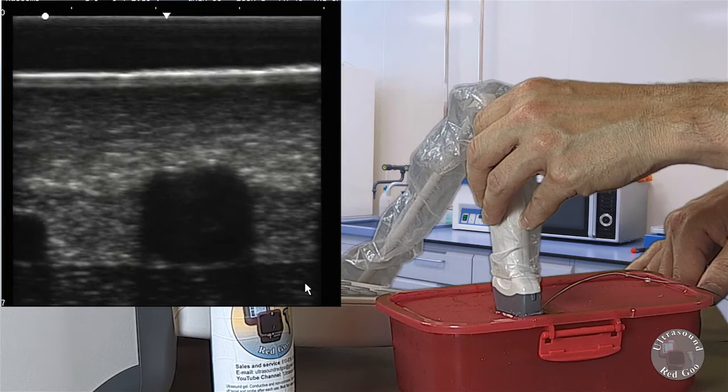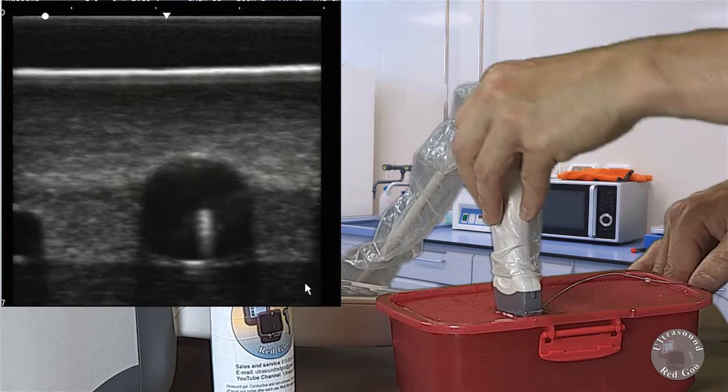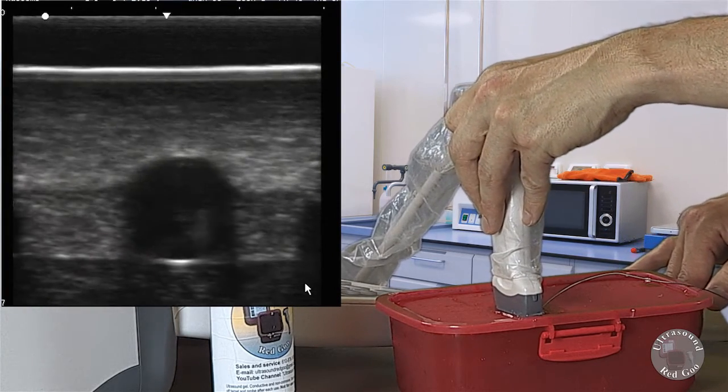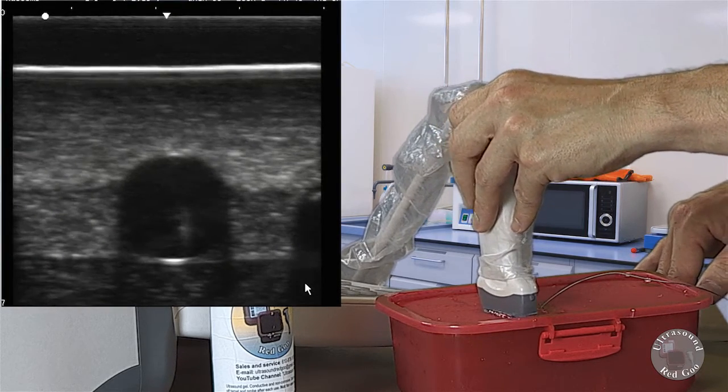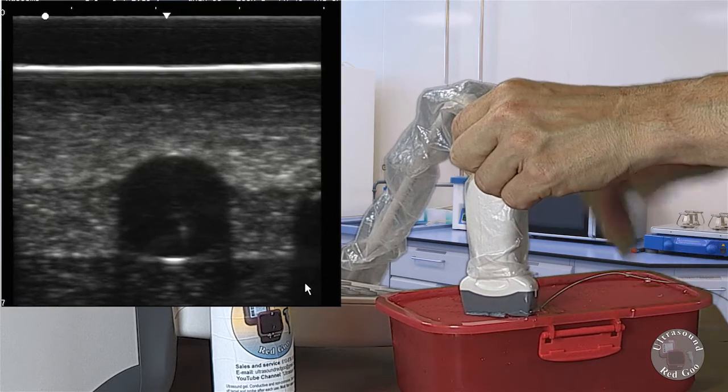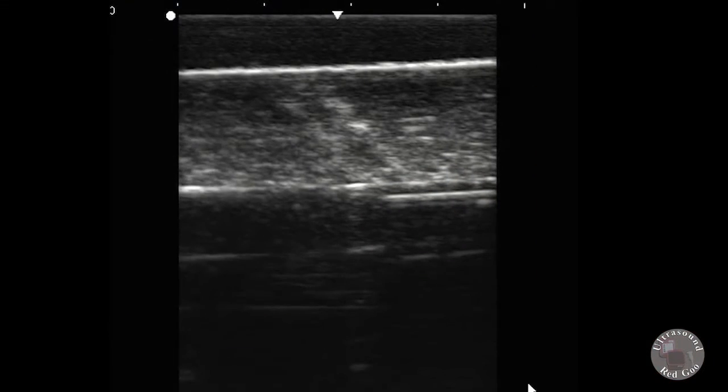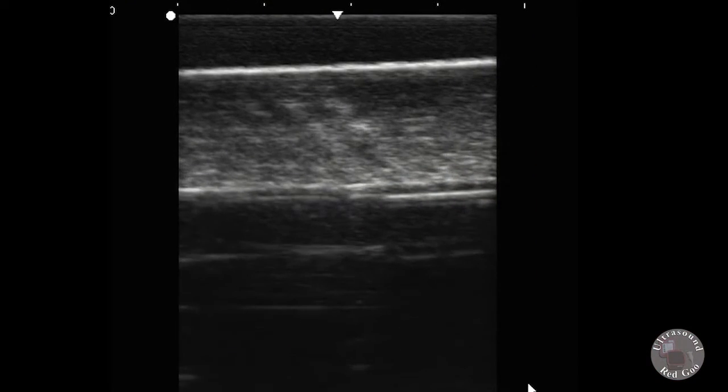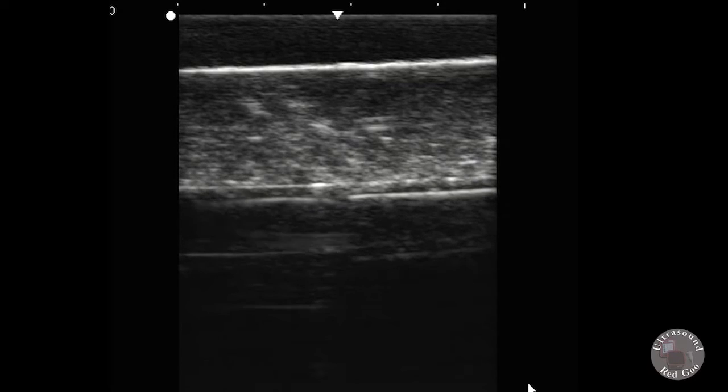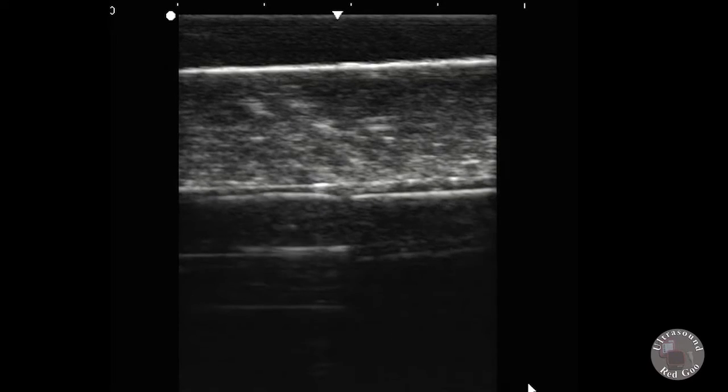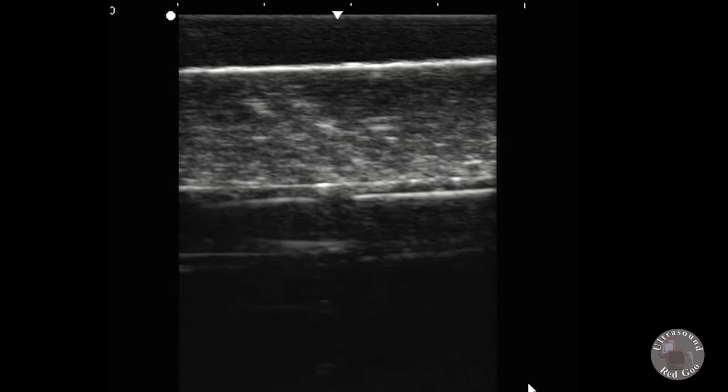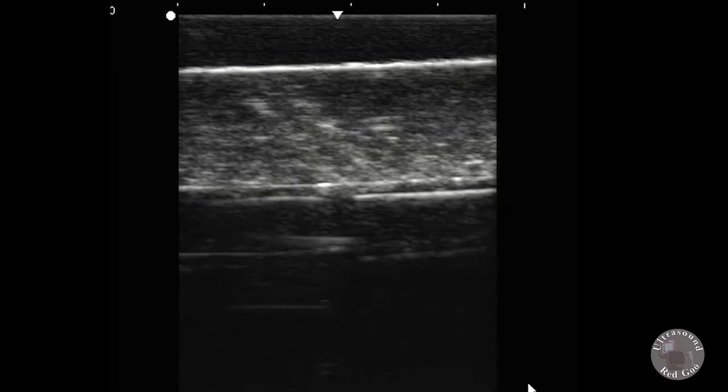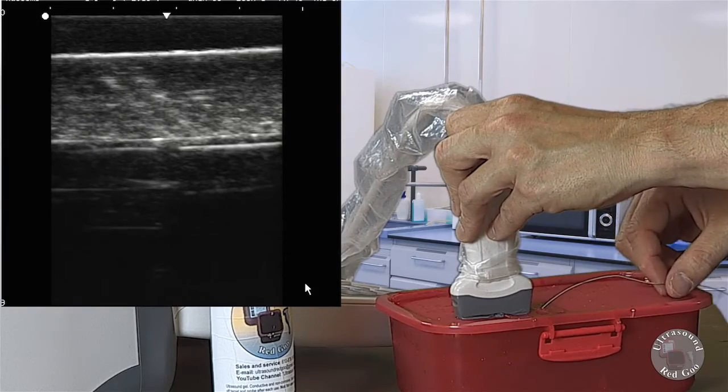So what I can do is I can assess the wire in the lumen of the vessel with both the out of plane and the in plane technique. So I'm going to rotate my probe 90 degrees - the probe marker is going to be facing me at this time - and I'm going to find the wire right there. I can just kind of move it around and you can see it on the screen moving. Okay, so that's in plane validation of where the catheter is.